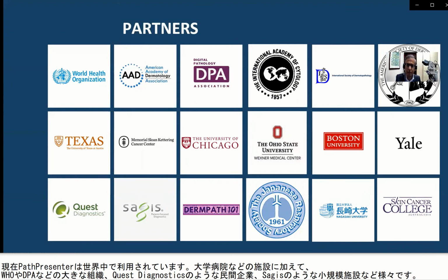Currently the PathPresenter solution is being used extensively around the world. There are multiple institutions like Sloan Kettering, University of Texas, University of Chicago, Ohio State University, Boston University, Yale, University of Colorado, big organizations like the WHO, the Digital Pathology Association, the International Academy of Cytology, even private pathology groups like Quest Diagnostics, or smaller groups like SAGIS and DermPath 101.